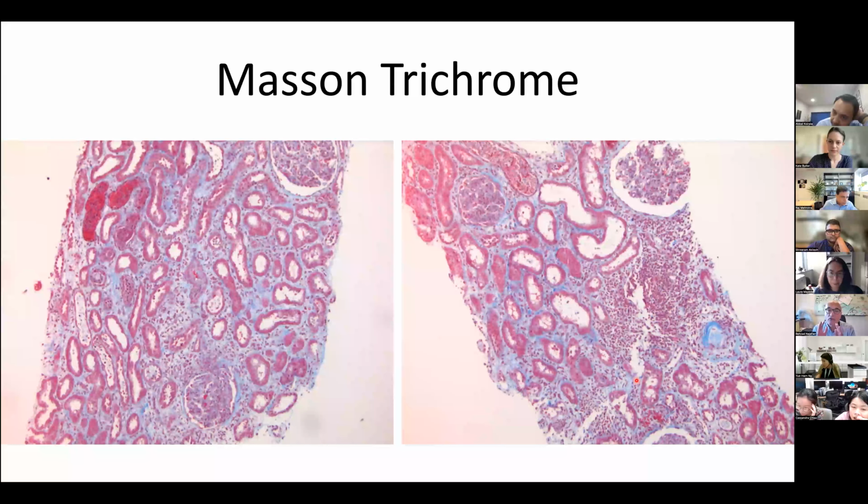They are not like chronic inflammation, the resting lymphocytes that you see in that condition. When I zoom in, you see that yes, there are a lot of neutrophils, there are histiocytes, there are active lymphocytes, and adjacent to those, there is a lot of edema. But there is some chronic injury percolating in.